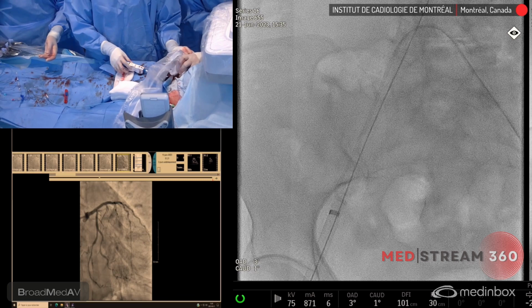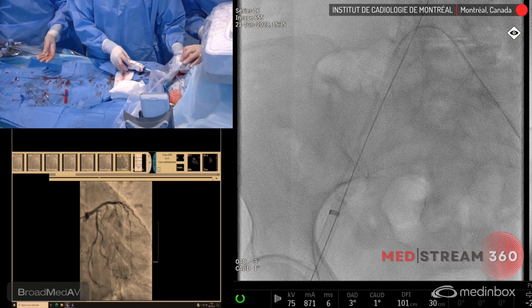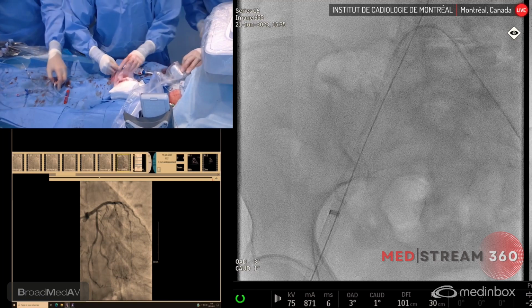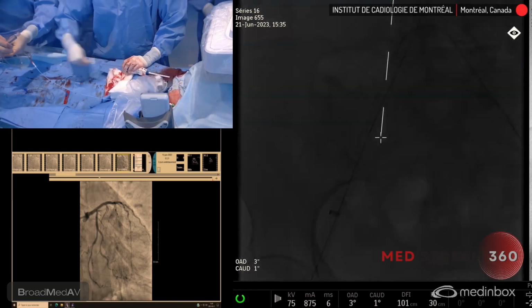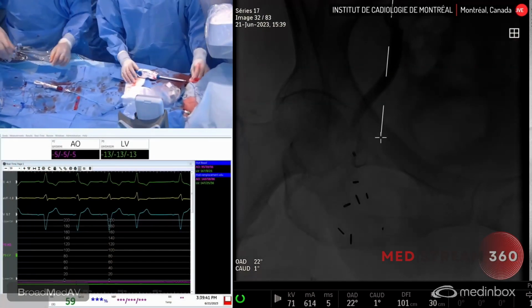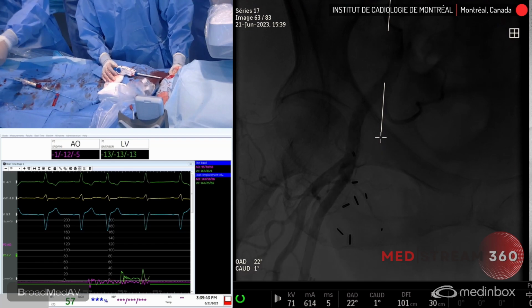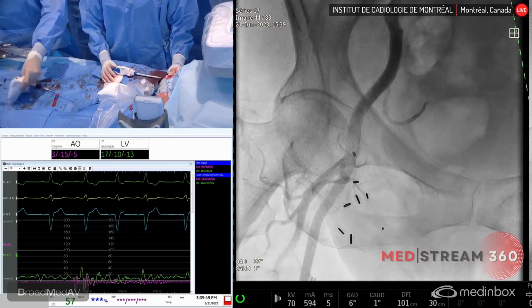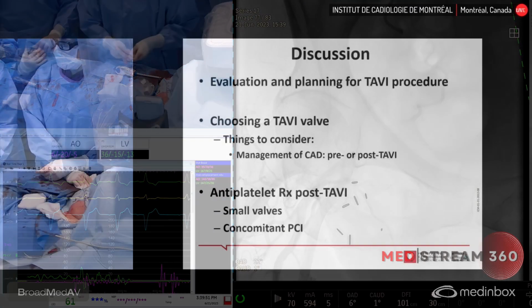The imaging's a little bit more challenging here, but we're going to take an angio now. So Ahmad's going to inject for us. Est-ce qu'on peut aller en angulation, s'il te plaît? I'm going to take out the wire of the Manta device. So you see the radio-opaque marker of the Manta device. You see very nicely there's no bleeding, there's no oozing. Vascular access looks good.